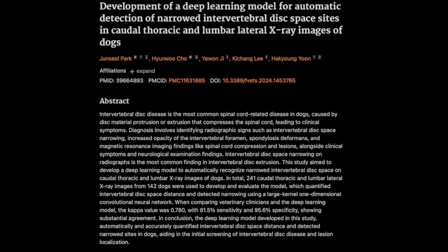They did this with a pre-processing algorithm that estimates a curved line connecting the centers of the vertebral bodies and measures the pixel distance between them. This approach cleverly accounts for the natural curvature of the spine, ensuring that the measurements are accurate. So the result is a vector of pixel values for each intervertebral disc space, essentially translating the image into numerical data that the AI can work with. So it sounds like a pretty sophisticated approach to measuring these tiny spaces on an X-ray.